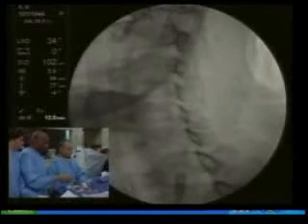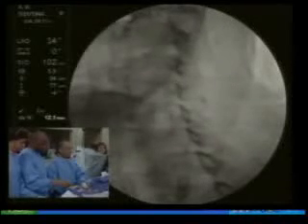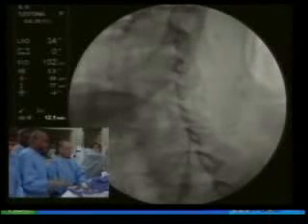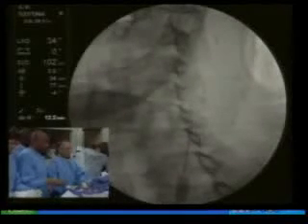Yeah, I see that, actually. You saw the dye going back into the sheath. So are you going to pre-dilate, Steve? Yeah, we're going to pre-dilate, so he's going to advance the wire. I want the angioplasty balloon. So what size balloon? Can I have a torquing device? It's on there. 4x2.